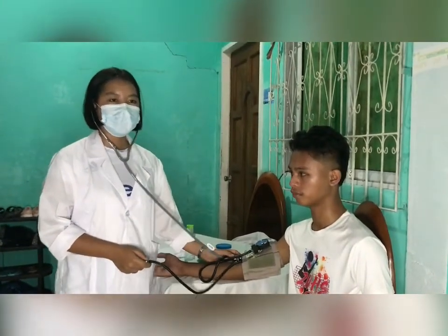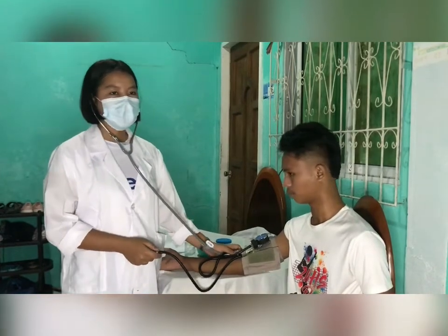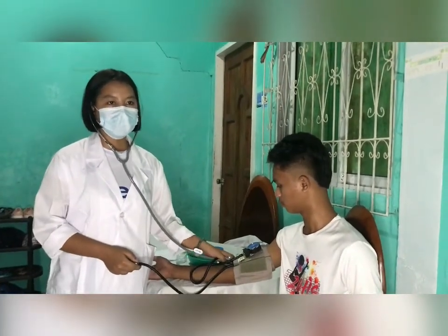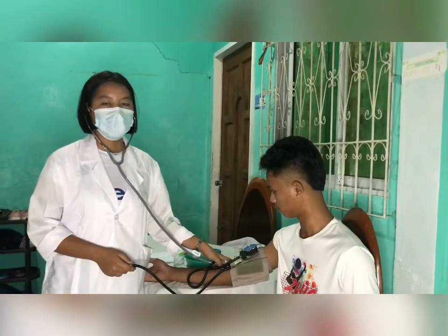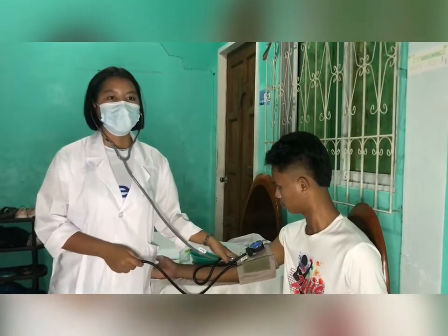Remove the cuff from the client's arm and assist the patient to assume a comfortable position. Cover the upper arm if it was previously exposed.